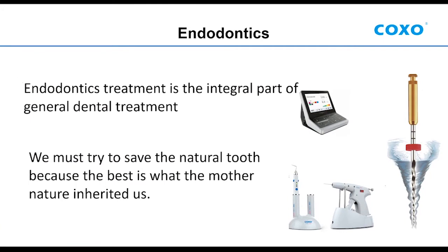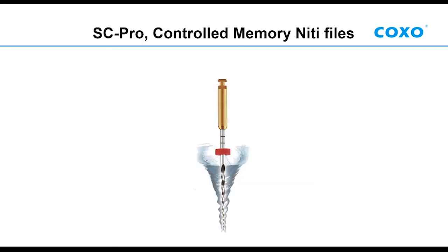So why do we need to use endodontics? Because in some countries, the dentist wants to persuade the patient to keep the teeth, so the future will be much better. But in some situations, the dentist directly takes out the tooth or uses an implant. In fact, the natural thing is much better. So it is better to use endodontics to keep the teeth for the future. Yes, to save the natural tooth as much as possible.